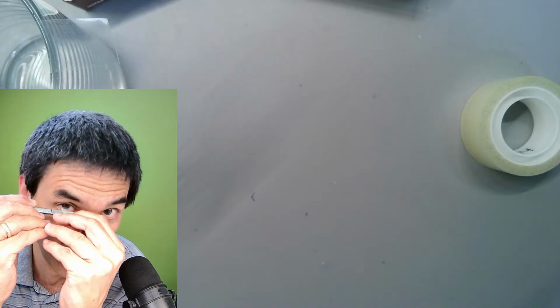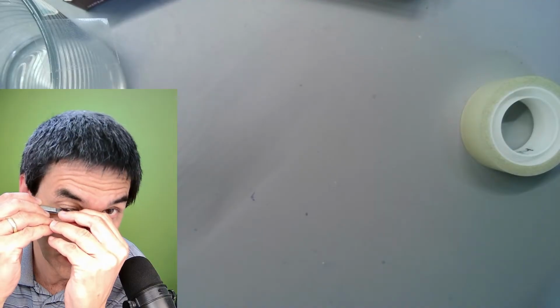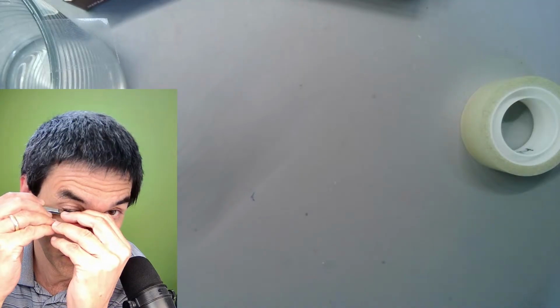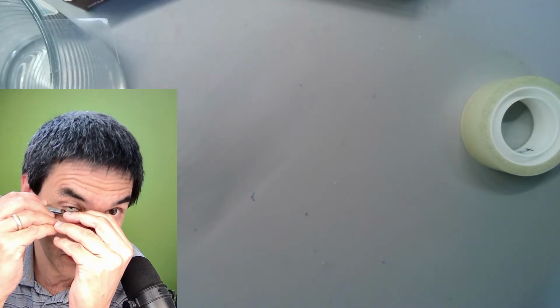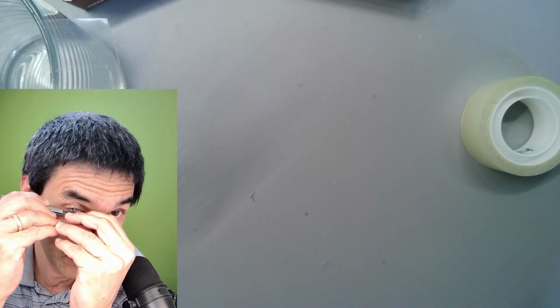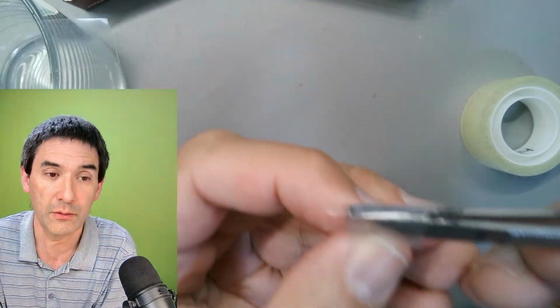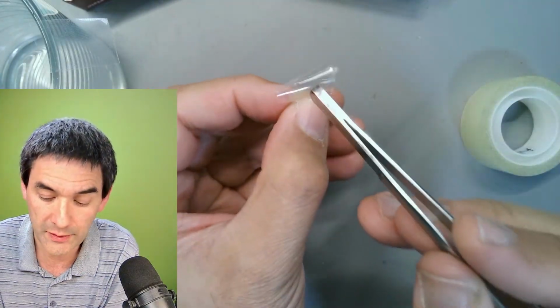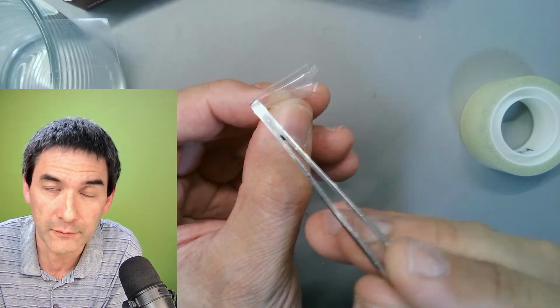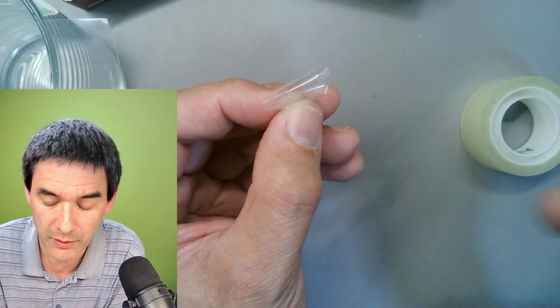Make sure that there's good contact. This is a little bit of a question of luck as well. I'm just going to leave it as it is now. What you have now is a line here where hopefully you'll have collected a face mite. We have to find this out.